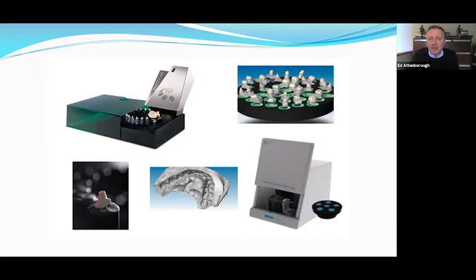Now, that's quite a clever file format. STL stands for stereolithography, and that comes from the original 3D printing back in the 1980s. And the way it works is that it has a mesh of triangles that represents the surface, and it's quite clever because it means that it self-optimizes.